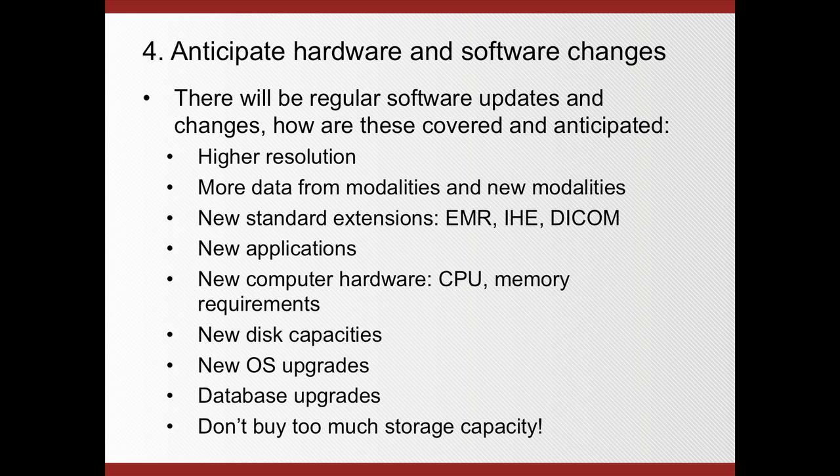Now, how are these covered? Do you have to pay for those? You should anticipate it because the changes will occur. And some of the differences will also include higher resolution. More and more the technology is not standing still, so you get higher resolution detectors. And that means higher resolution data that you will have to facilitate. There's going to be higher resolution monitors.